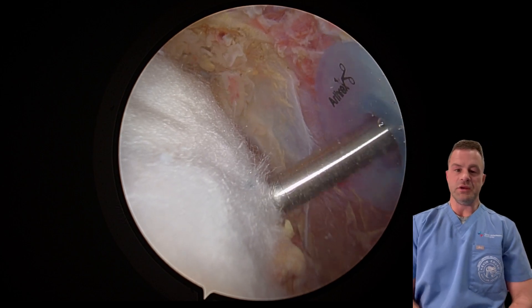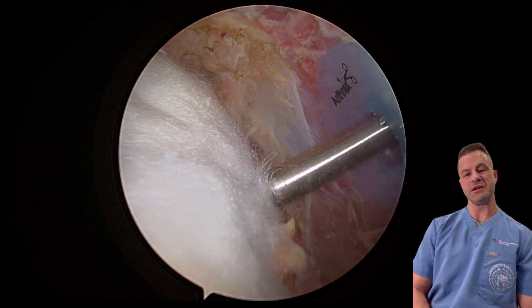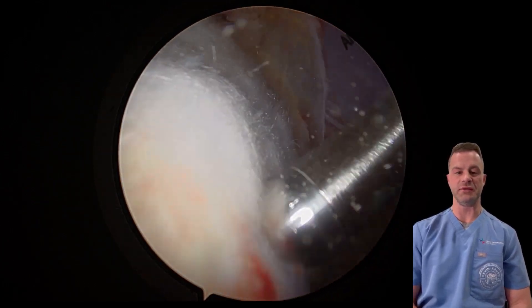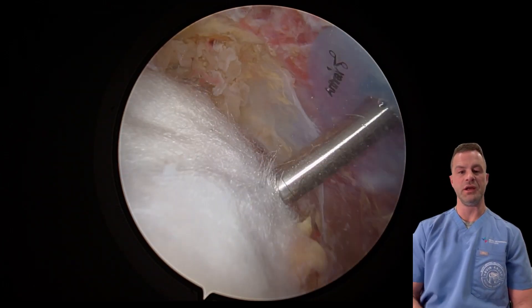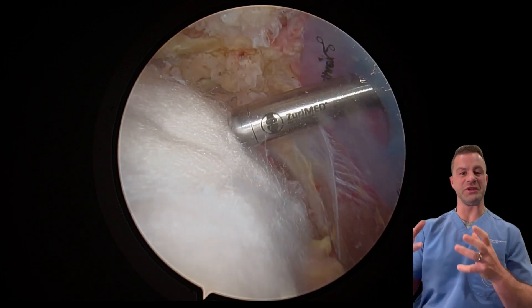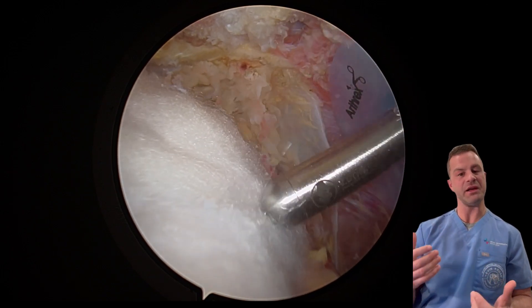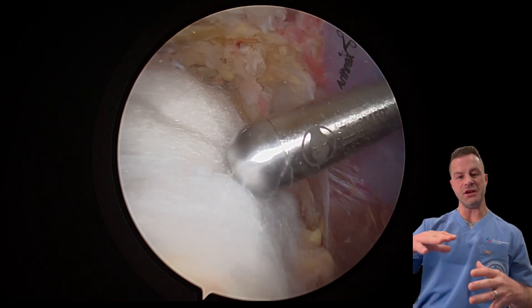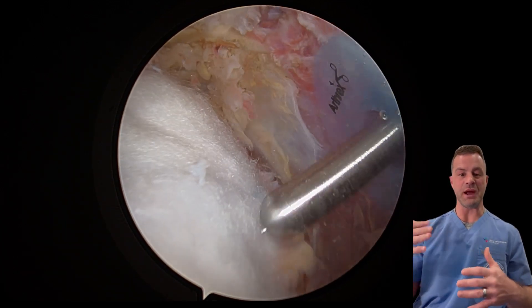There are many unique things that we do in our shoulder surgery practice, but I think one of the most exciting ones is the utilization of an implant called the Speed Patch and the Fiber Locker. It's by a Swiss company called ZuriMed, and this is a new technique to repair rotator cuffs.